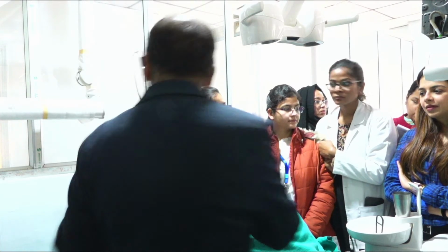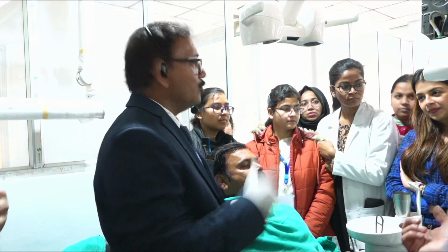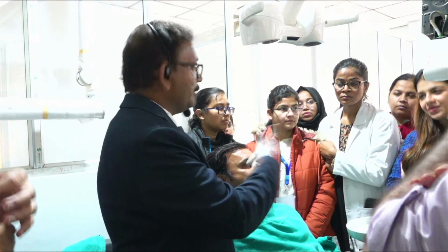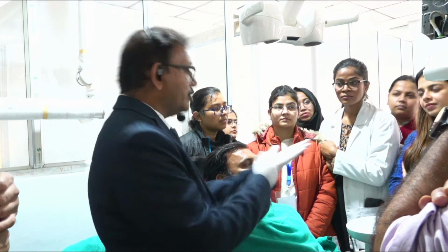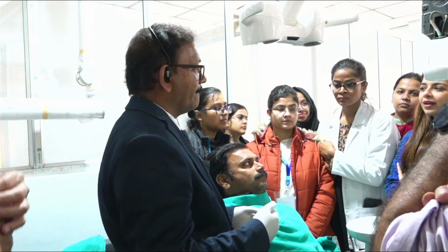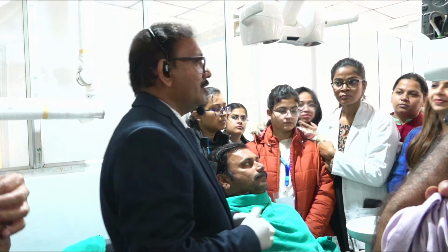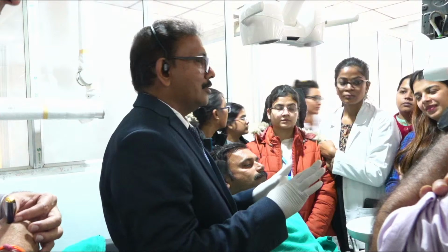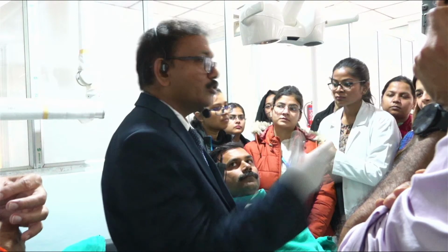You can use this laser. Probably he wants to ask whether it has to be coupled with laser or alone. Whether she can use a hydrogen peroxide base with this laser? Same procedure you can use. You can have the gingival barrier and use this laser at 4 watts, and whatever the prescription on that. Light curing, most of the Chinese products which are being used are not at all 430 nanometers. And you will blame the dealer or the person who has sold you something, like most of the time it happens.